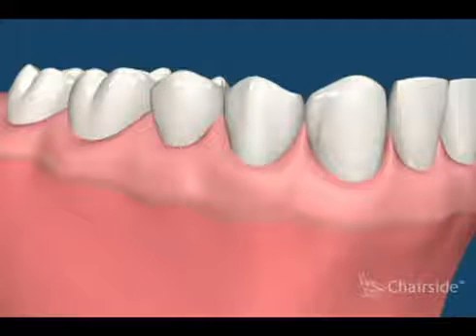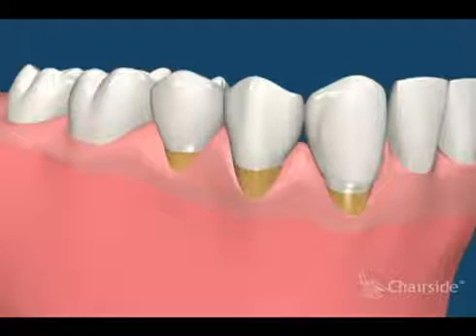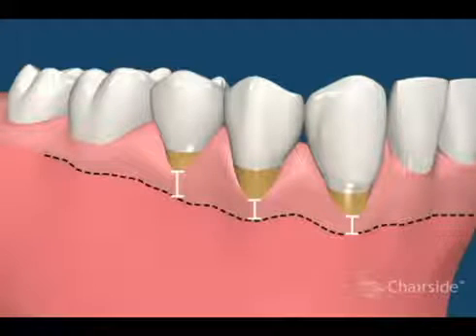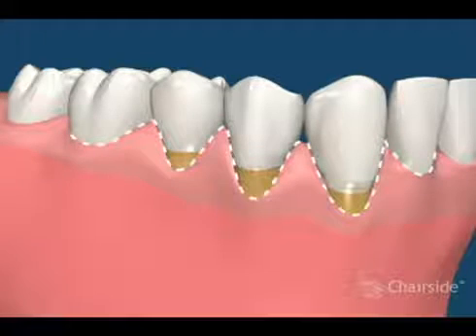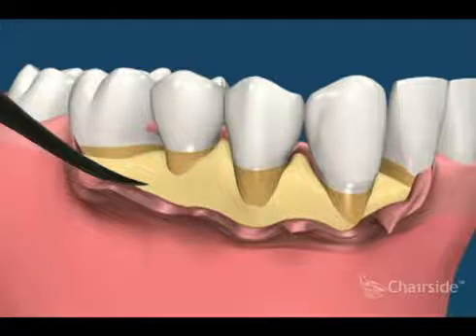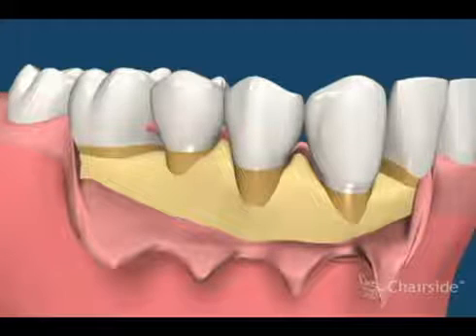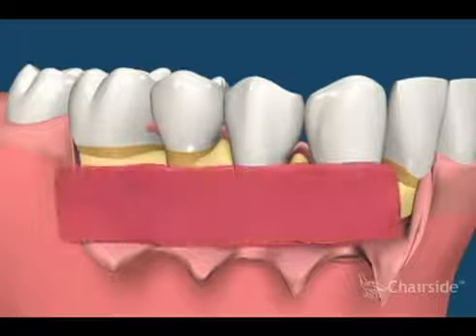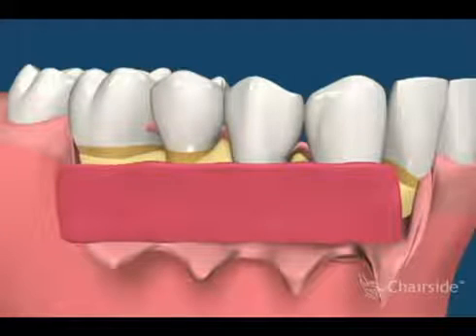Teeth may experience recession, where the roots become exposed. This movie demonstrates a situation where some teeth have also lost their tough gum tissue, or attached gingiva. Attached gingiva holds the gums firmly to the teeth and prevents calculus or tartar building up between gums and teeth. To treat this condition, the flap is reflected from the teeth. A prefabricated human graft tissue can be placed into the area.